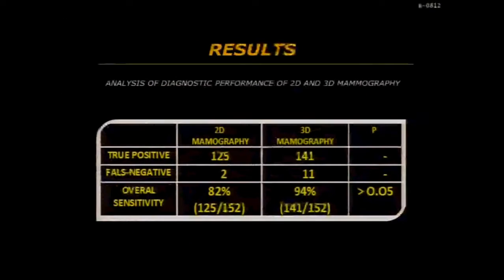When we analyze the diagnostic performance of 2D and 3D mammography, we have an overall sensitivity in multicentric cancer detection of 82% on digital mammography and 94% on 3D mammography.